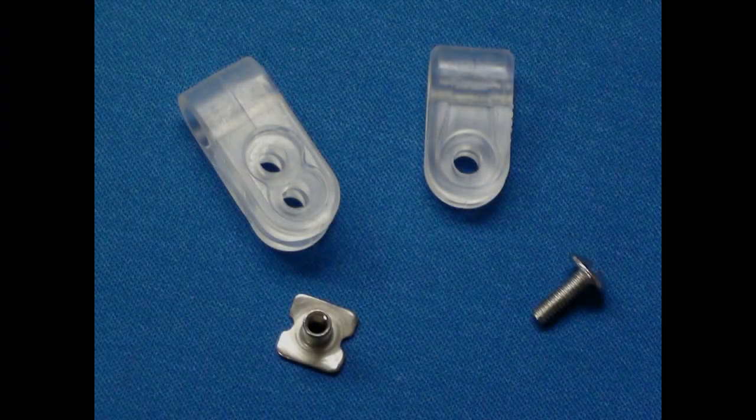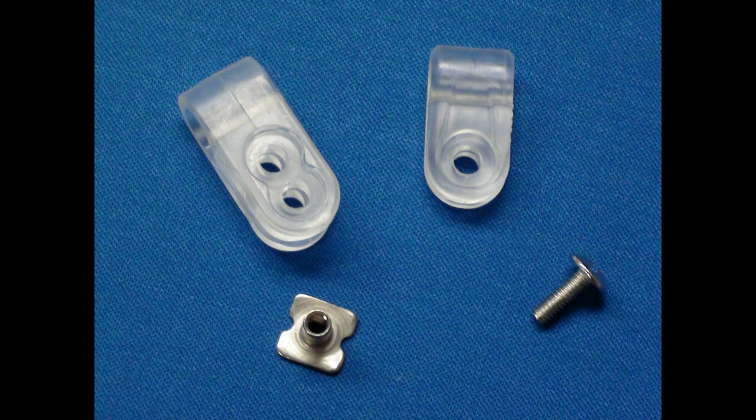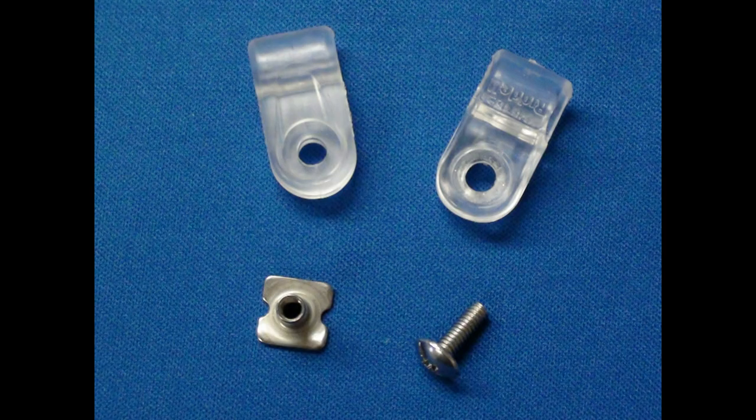The forehead fasteners on the Revolution Speed Football Helmet resemble smaller, less bulky versions of more traditional loop strap fasteners. This makes them quite easy to cut using the same FM Extractor techniques for cutting through traditional forehead loop strap fasteners in the event that removal using a power screwdriver is unsuccessful. The forehead loop strap fasteners do come in a thick and thin version depending on the thickness of the face mask bar, but this is of no consequence to face mask removal.